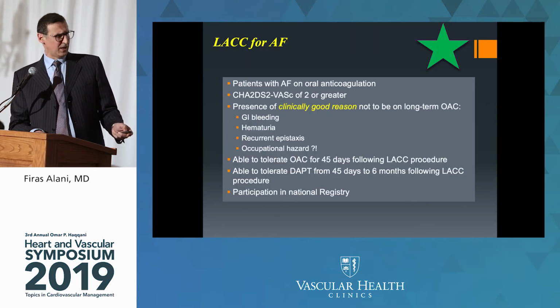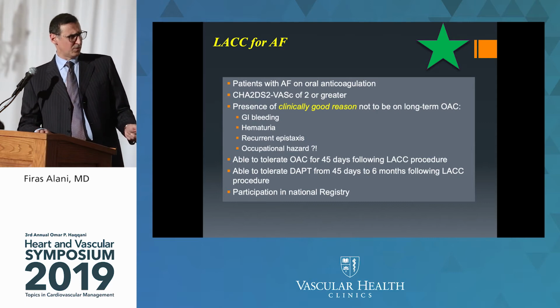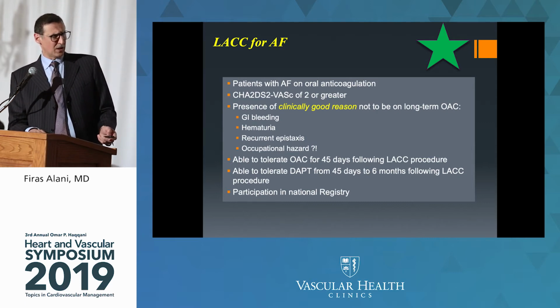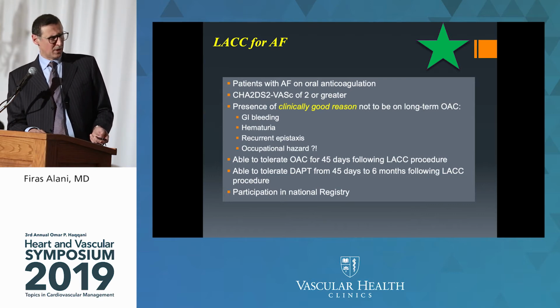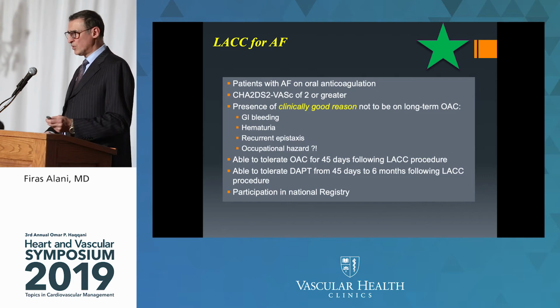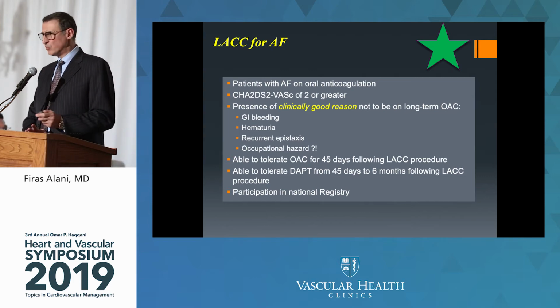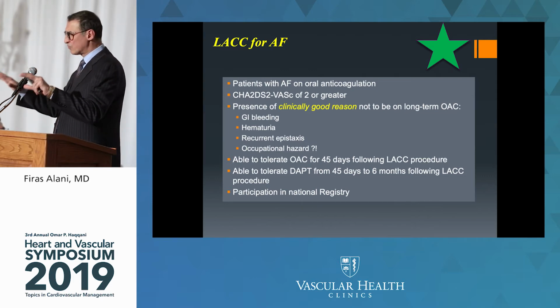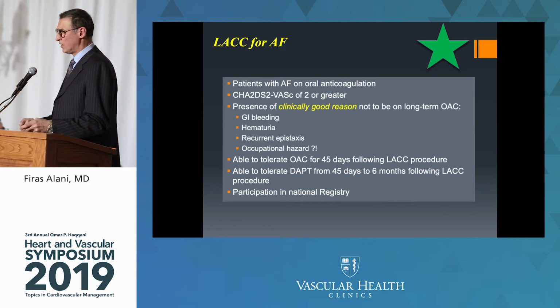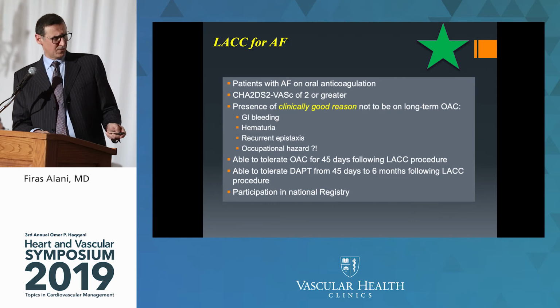So who gets the left atrial appendage closure device? Patients who have atrial fibrillation on oral anticoagulation, have a CHA2DS2-VASc score of 2 or more, and have a clinically good reason. This is the wording in the white paper, clinically good reason. Whatever that is, it is at the discretion of the referring doctor that the patient has a clinically good reason to come off the anticoagulation.